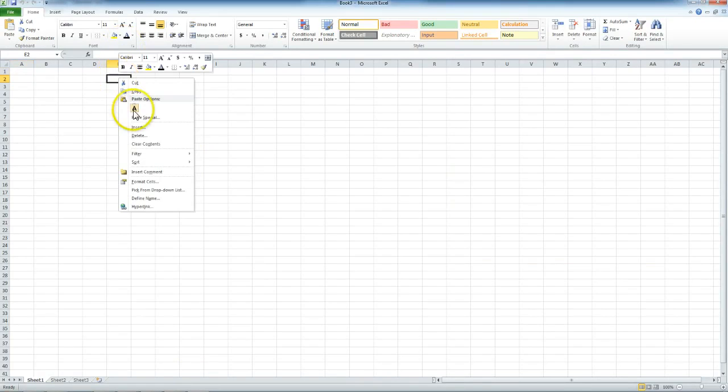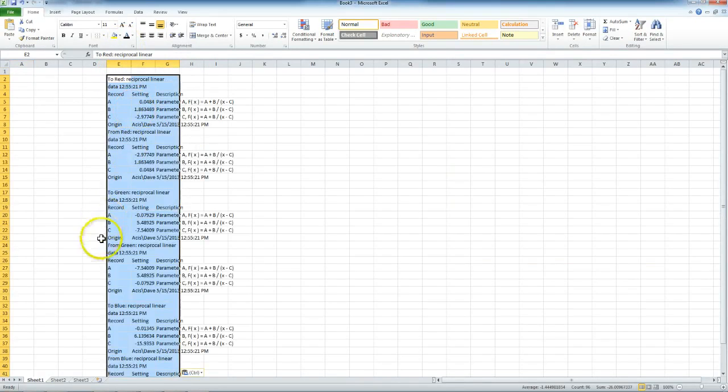The fitting functions are generally expressed as either response as a function of dose or the inverse, dose as a function of response, where the response values are expressed as percent, that is, the 16-bit value divided by 65,535, and dose is given in gray.